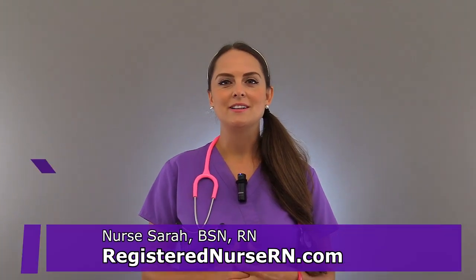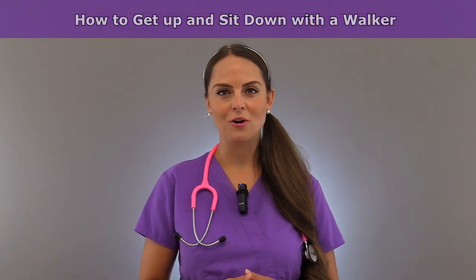Hey everyone, it's Sarah with RegisterNurseRN.com and in this video I'm going to demonstrate how to get up and sit down in a chair with a walker.